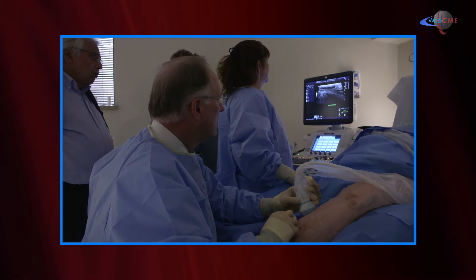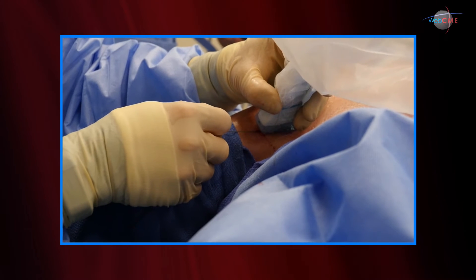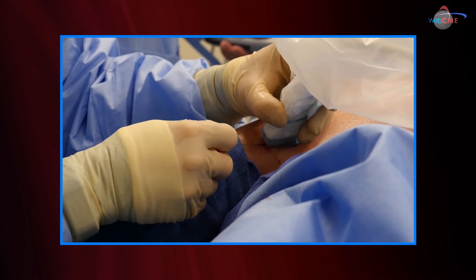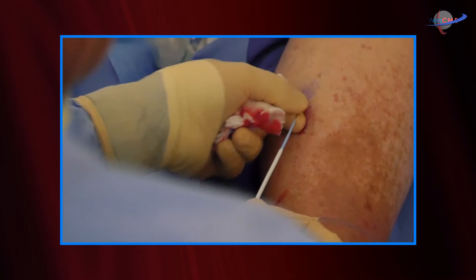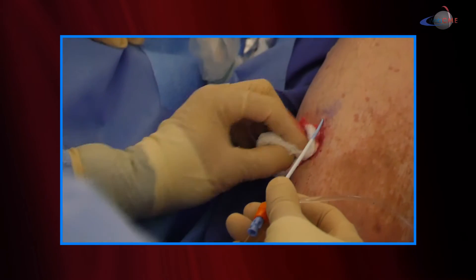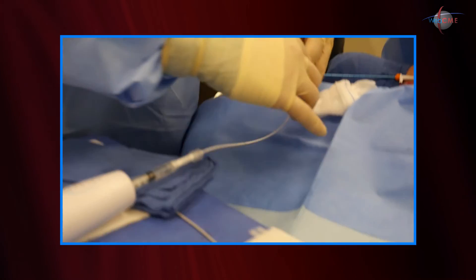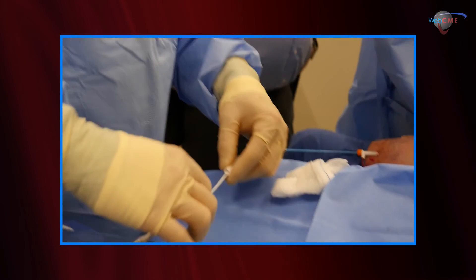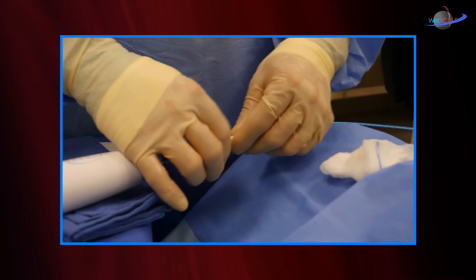A small puncture is made over the identified incompetent vein. Access to that vessel is secured with a needle. A wire is then passed into the vessel, into the vein, and then we pass a transducer — an introducer — into that vein to allow us access to the vessel. Following that, we introduce a catheter, which can be a laser catheter, a radio frequency catheter, or the new cyanoacrylate glue catheter.